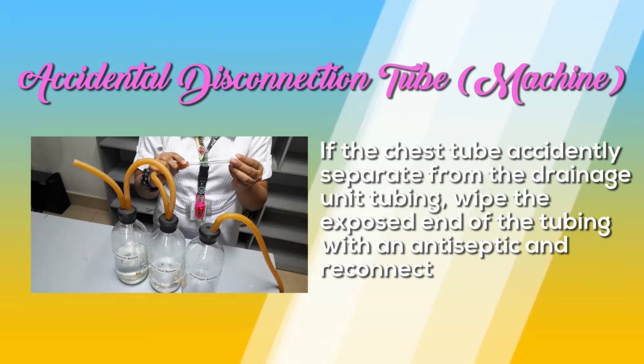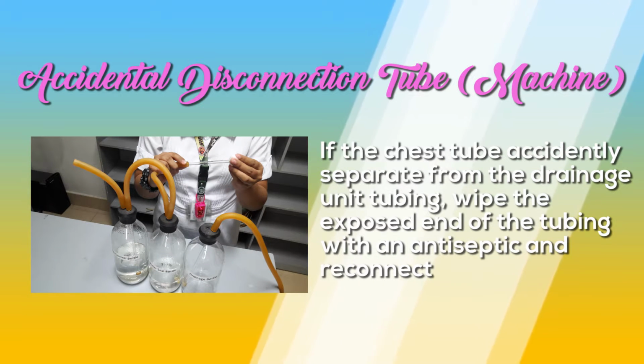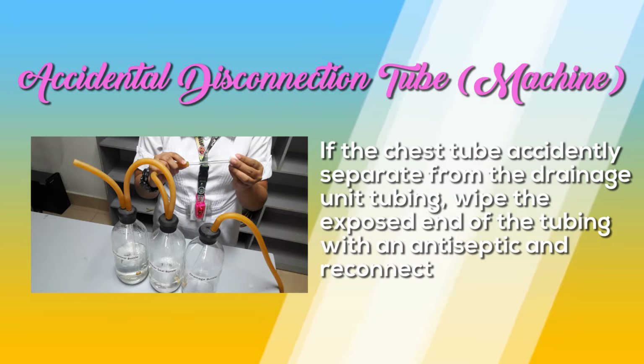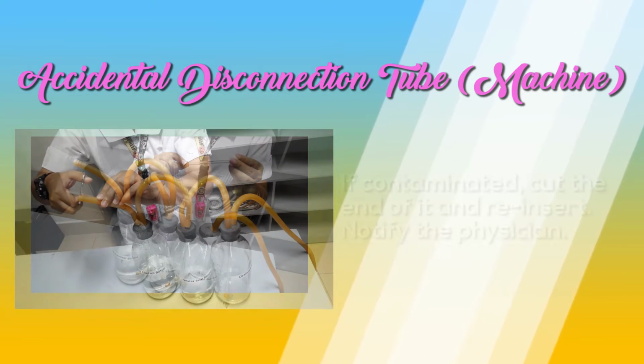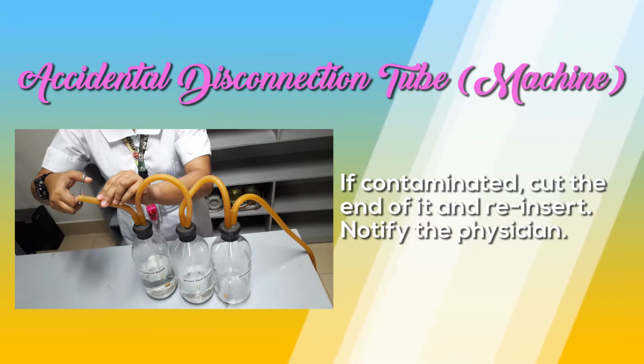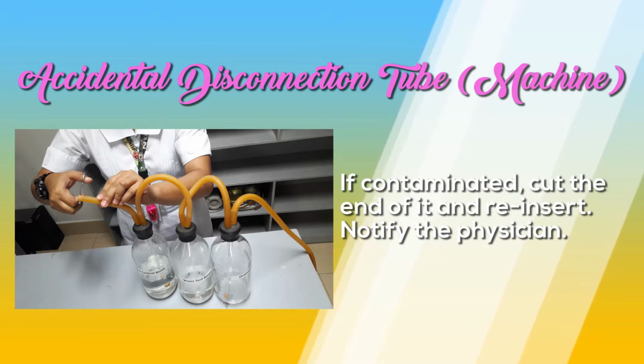If the chest tube accidentally separates from the drainage tubing, wipe the exposed end of the tubing with an antiseptic and reconnect. If contaminated, cut the end of it and reinsert, and then notify the physician.